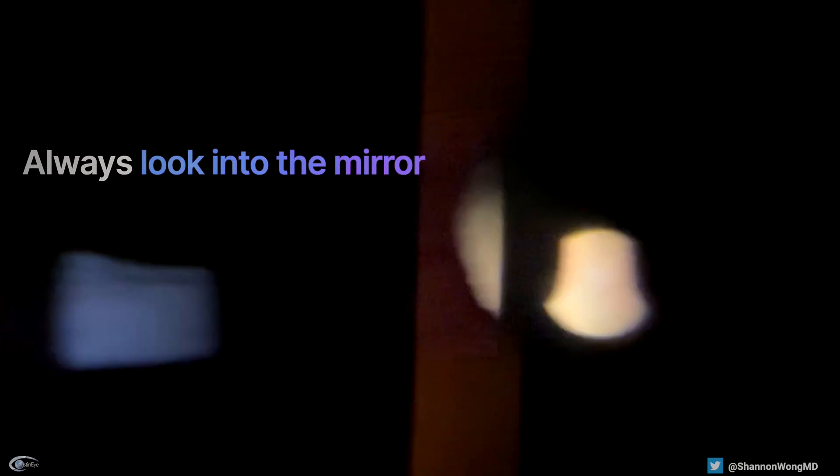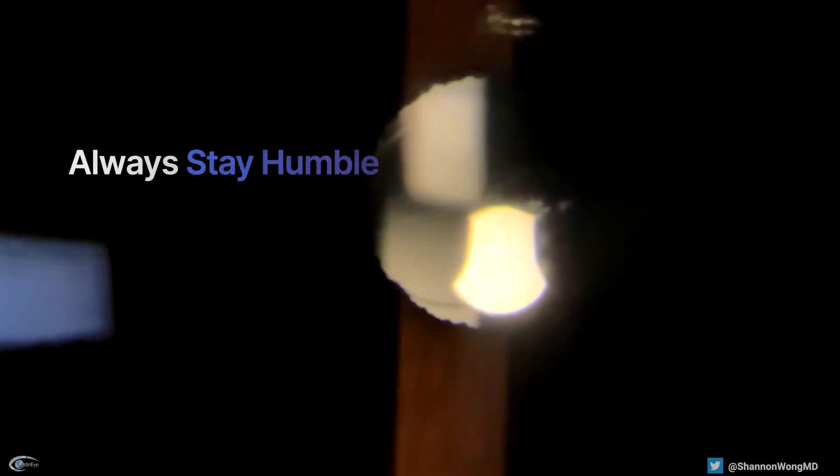Lessons learned? Look into the mirror. Or in this case, go back and watch the video when complications occur. You can learn a lot and always stay humble.